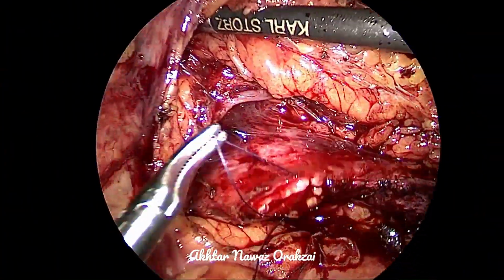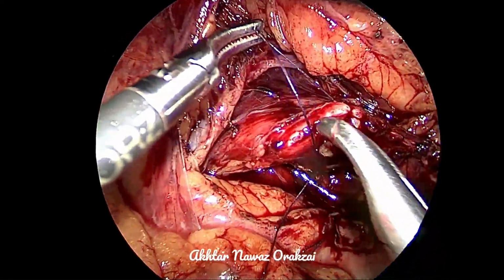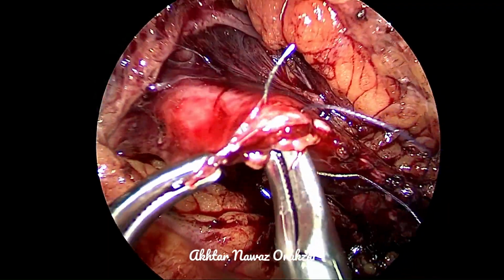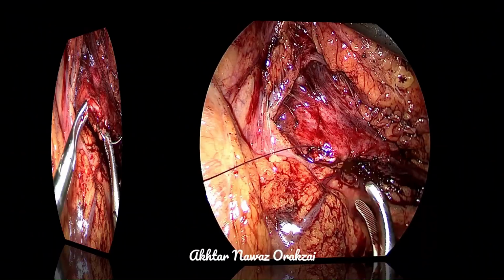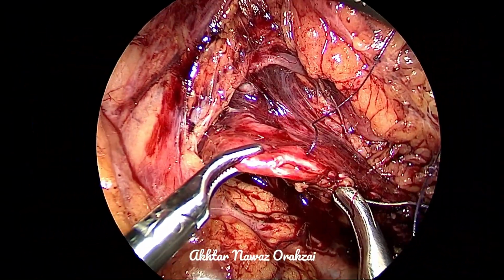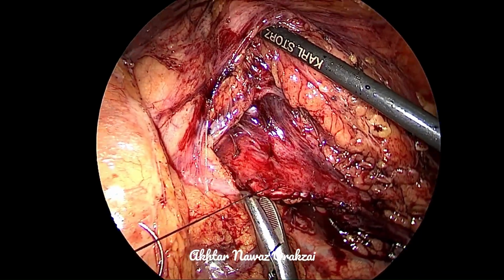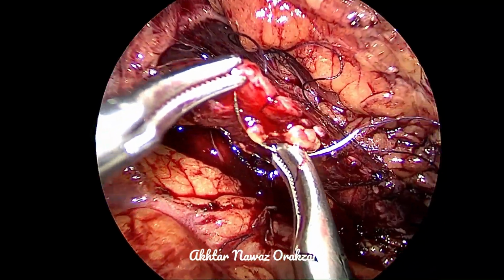Here you can see the posterior suture line. This is the anterior, this is the posterior, and now the pelvic portion. So you can see the glare from the DJ stent, which is very near to the edge. That's why it is really advisable if the stent is pushed into the upper calyx, so that it remains away from the suture line.